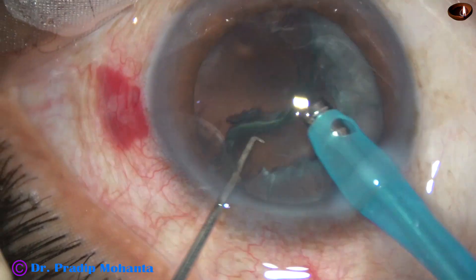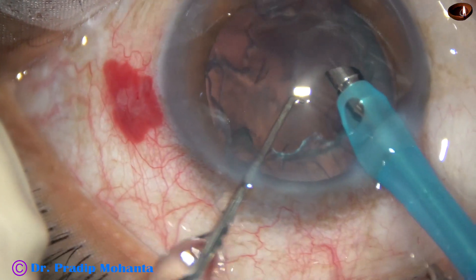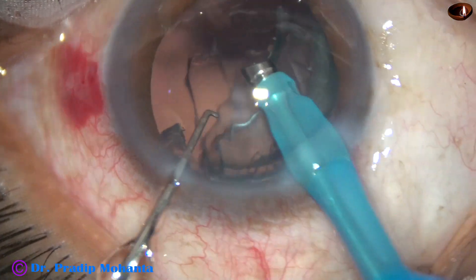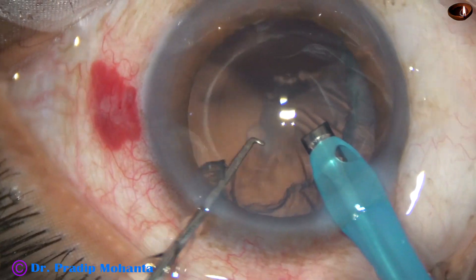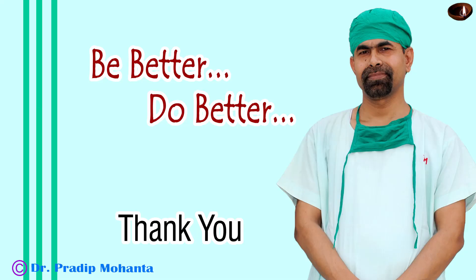This maneuver is not recommended for beginners. We should do some hydro again, and the epinucleus should be brought to the center, then it can be either removed by the phaco needle or by irrigation and aspiration. Thank you very much for your attention. Hope this video will help you in developing your surgical skills. Be a great surgeon and serve your patients with love, respect, empathy, and great surgical competence.